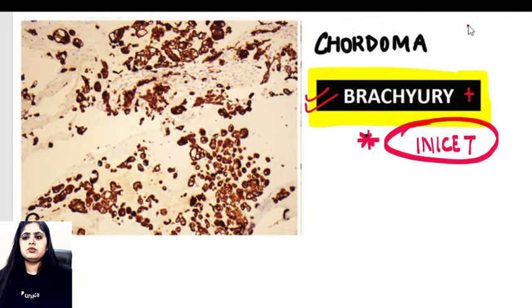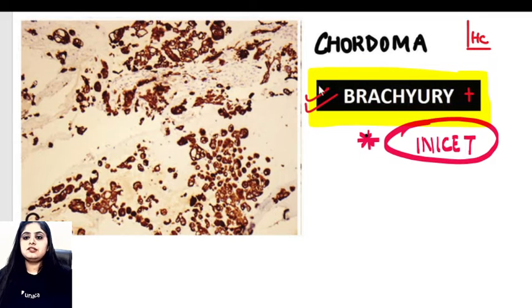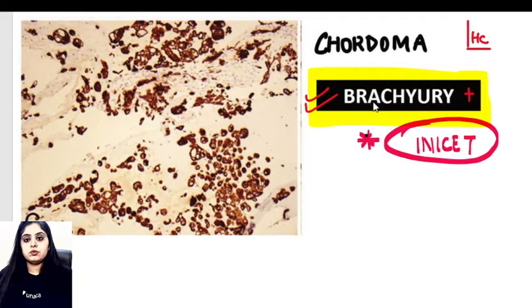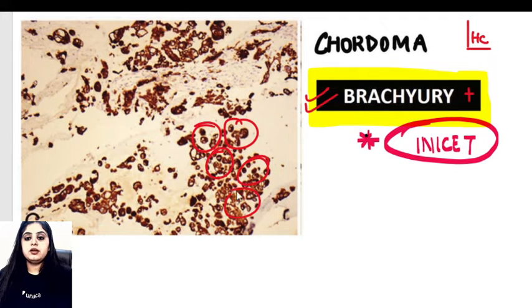Immunohistochemistry produces a brown color stain. So when immunohistochemistry with brachyury is performed on this tumor, the cells come out brown in color.